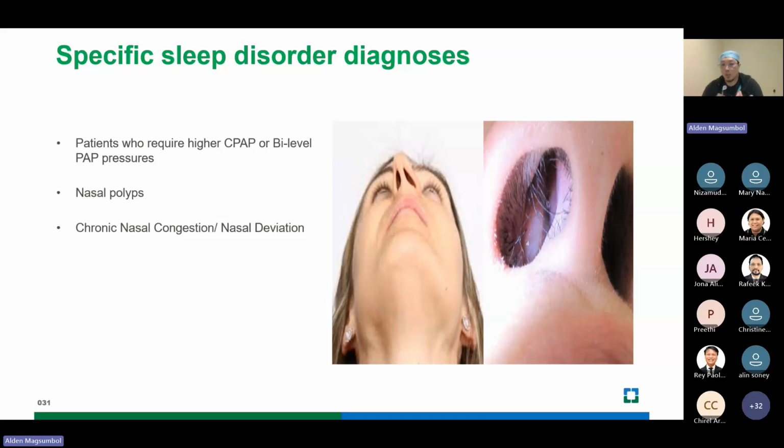Whether a patient primarily breathes through their nose or through their mouth can determine the most suitable mask type for that patient. Habitual mouth breathers who cannot tolerate the nasal mask require an oronasal mask in some cases to prevent air leaks and ensure effective therapy for this particular patient population. They may need a higher pressure as well.